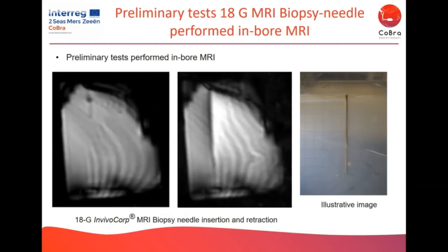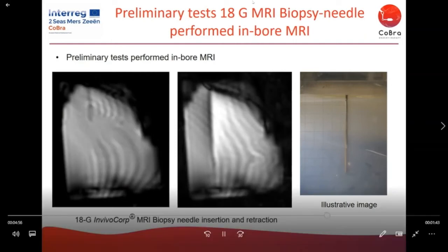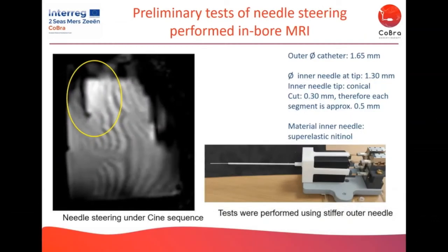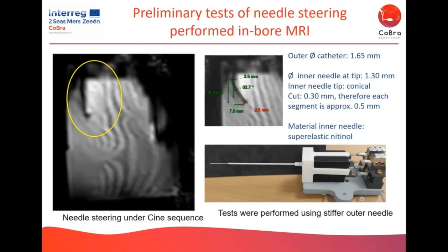The phantom imaging quality was not good, as reported by the MR operator, and he tried to optimize some parameters, but we were not successful, so we intend to improve in our next tests using a commercial CIRS phantom. And our project partner is also working on the optimization of the image sequences. Following the test of the straight in vivo MR needle, the steerable needle tests were performed with the same phantom. The needle was steered in open loop and performed the desired functioning and steering. As you can see from the video, the needle is able to bend and is detectable under MR images.